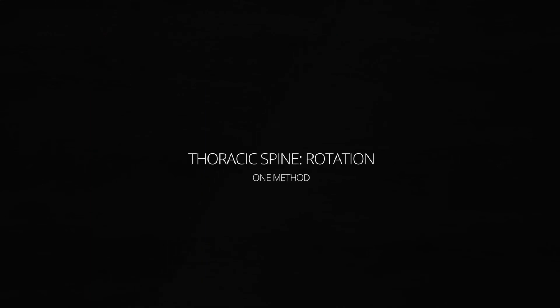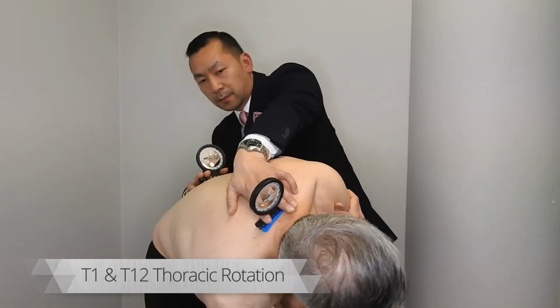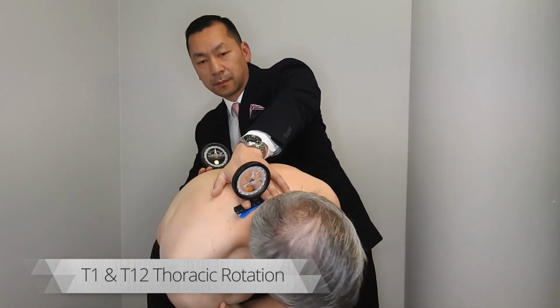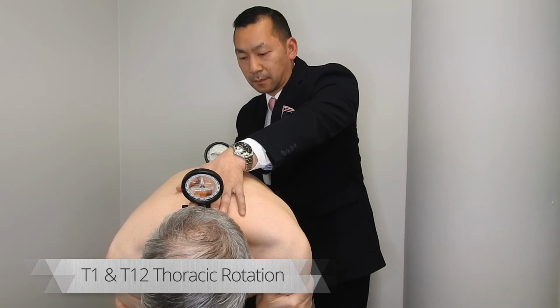Thoracic spine rotation. Again, subtract the T12 from the T1 measurement to obtain the degrees of thoracic rotation, and repeat at least 3 times each.